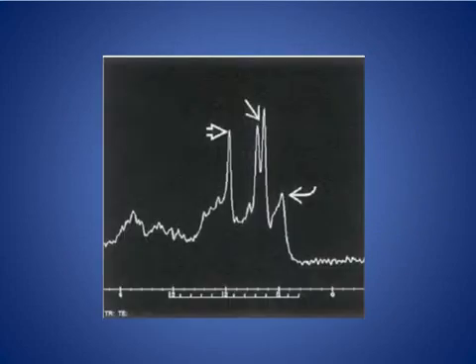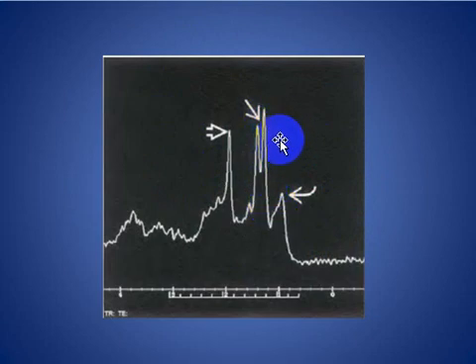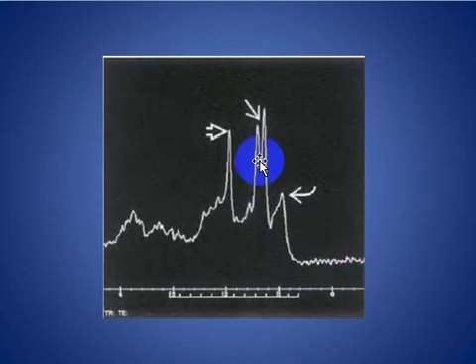MRI spectroscopy of the abscess cavity shows a double peak of large lactate and a large peak of acetate, with a small peak of cytosolic amino acids — consistent with abscess.